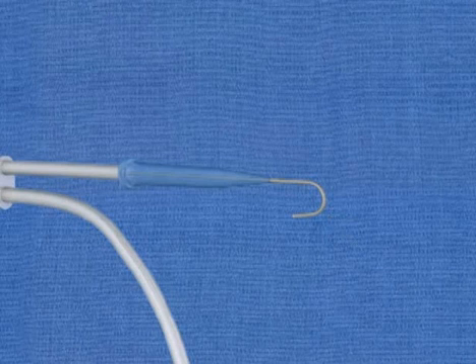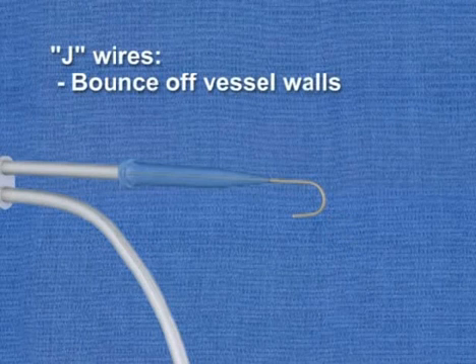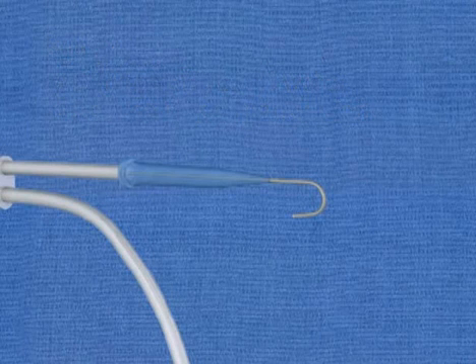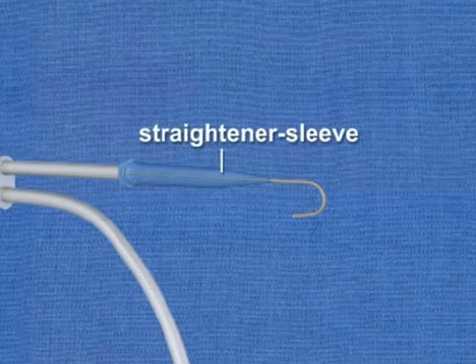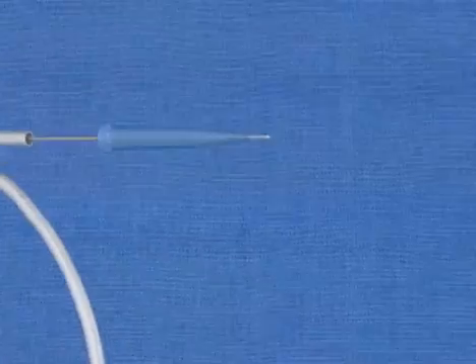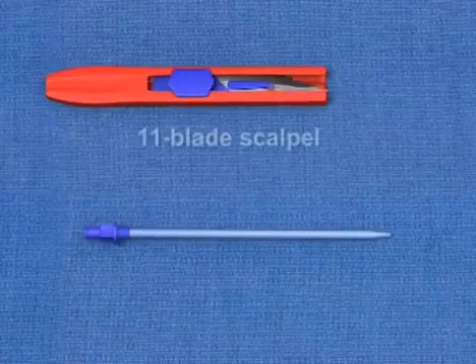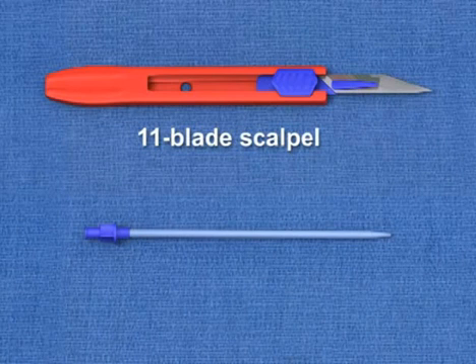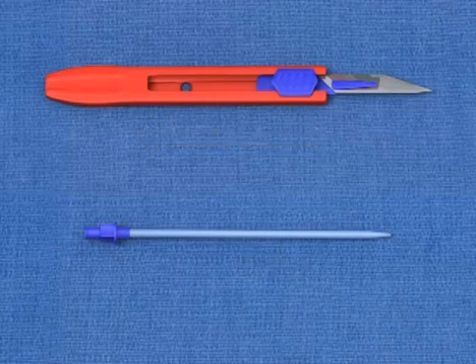The rounded, leading edge of such J-wires allows the wire to bounce off the vessel walls, reducing the risk of vessel perforation. Note that the guide wire housing has a straightener sleeve that facilitates the insertion of the wire into the needle hub. An 11-blade scalpel, which is used to make a nick in the skin to allow passage of the catheter through the epidermis. A dilator, which is used to create a tract in the subcutaneous tissues for the catheter.